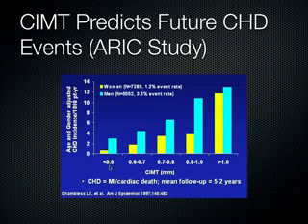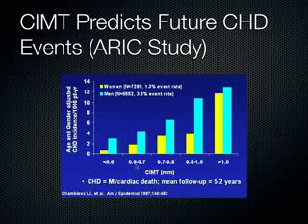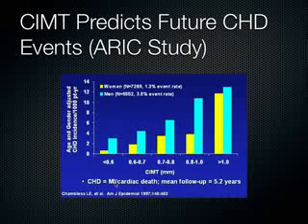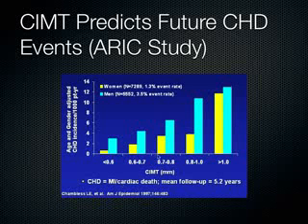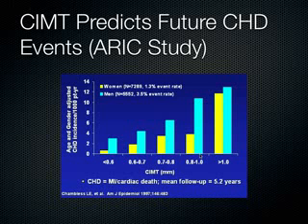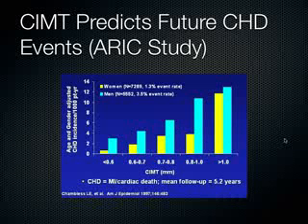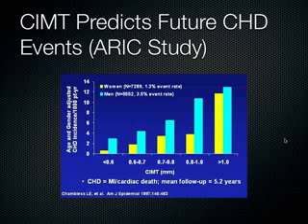So it's not surprising when you start to think about it, as that carotid intimal medial thickness starts to get larger and larger and larger, the odds of having a heart attack or dying from cardiac death go up as we go here. And so I think this is one way to kind of help show your patients right there at the bedside that they really should be taking their antihypertensives and also their anti-cholesterol drugs, because I think showing them their intimal medial thickness and a graph like this will help them be sort of more compliant with those types of medications.